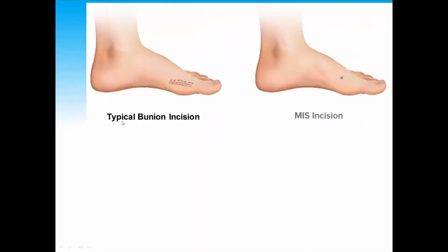Again, the traditional incision versus the minimally invasive incision, typically it's 10 to 20 millimeters in length, depending on the patient.